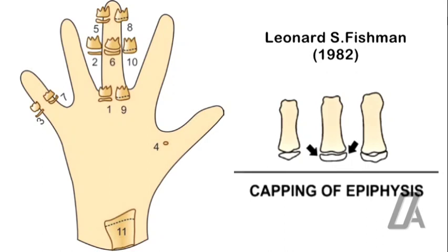Next, there is capping of epiphysis in the distal and middle phalanx of third finger, and middle phalanx of fifth finger.